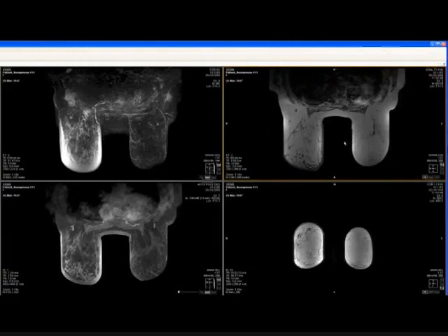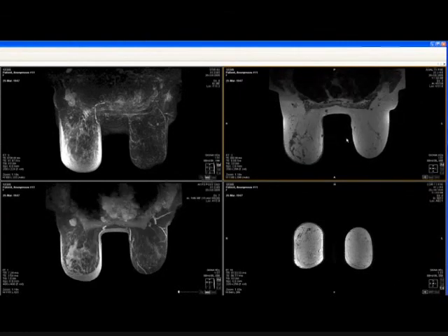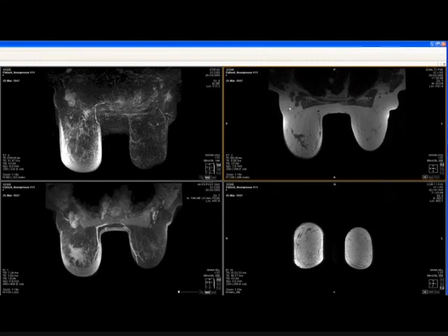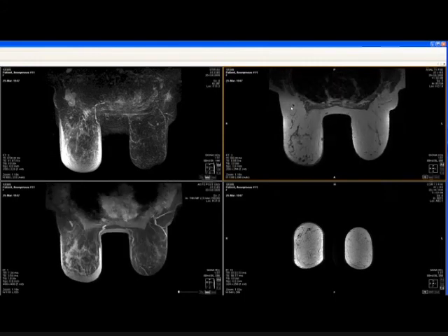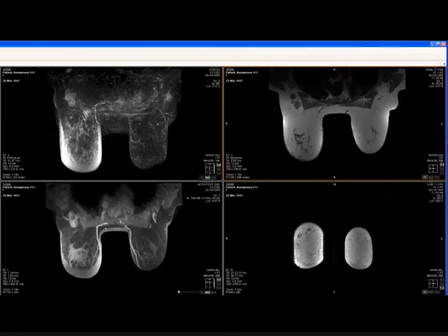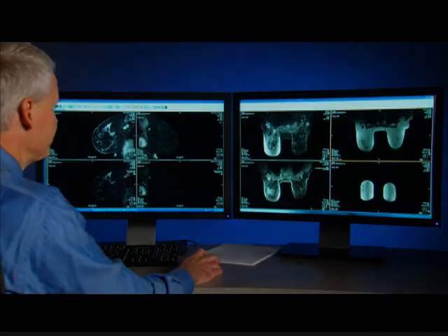In this patient, just to show an example, there's nothing subtle about this, but as we look at our T1 images, you can see this pronounced pathologic lymphadenopathy of the level 1 axillary lymph nodes of the right breast. So this is just a nice example. You can see here the spiculated mass of the characteristic findings of inflammatory breast cancer.